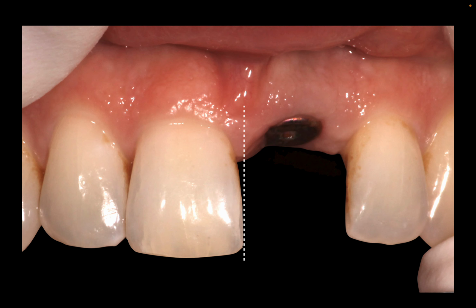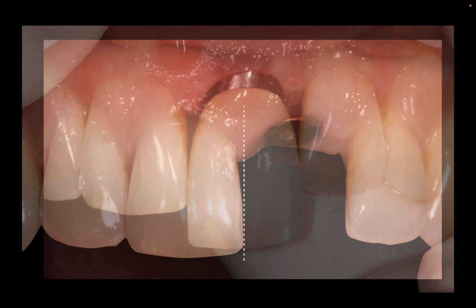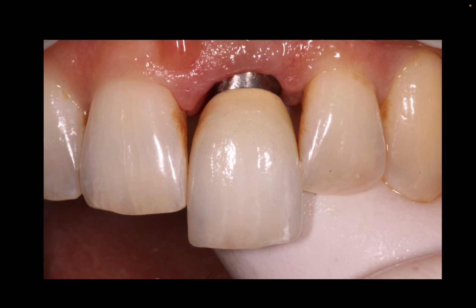While it's only a 1, the question is, can we make it a 2? Can we go from good to excellent? We're going to do that using our critical contours. Understand, the critical contour can be worked out not only in the abutment, but also in the restoration itself. Let me show you how this happens and what we did.